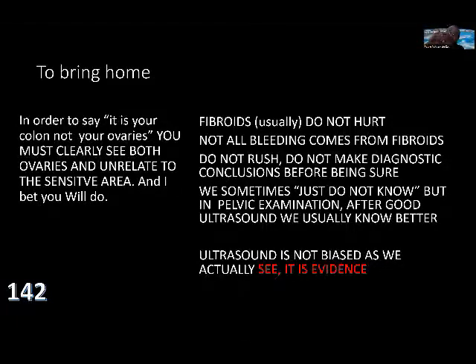Fibroids usually don't hurt. And not all bleeding comes from fibroids. Remember, endometrial causes of bleeding are important. Take your time. I trained this in a hospital where we used to see with 3 ultrasound machines, 100 patients a day. 3 of us, 100 patients a day, 30 patients a day.